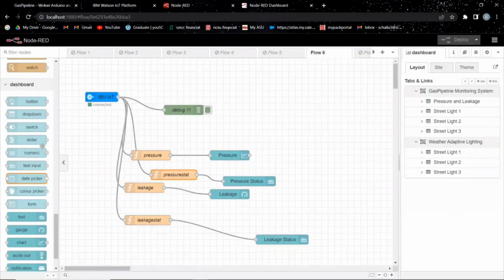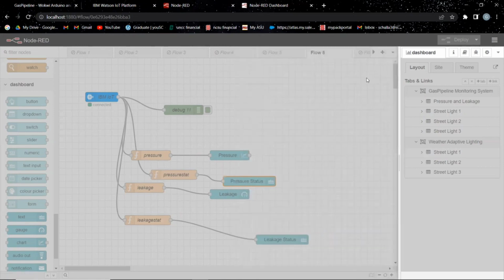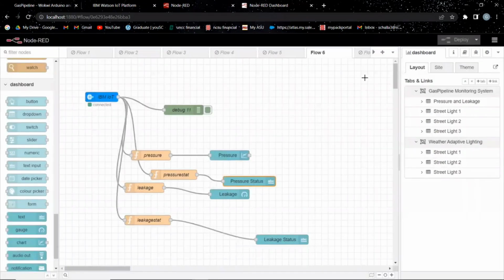So for showing the alert message, we generally make use of the text box. So to configure them, you have to again double click on the node. So select the value format, place them in the appropriate group, and also select the proper layout and click on done. So similarly, as we have done for the pressure values, do the same for leakage values. For leakage, we are selecting the gauge tool.